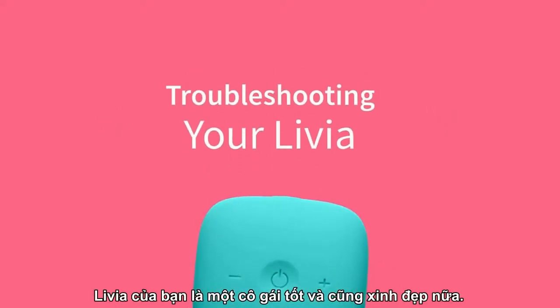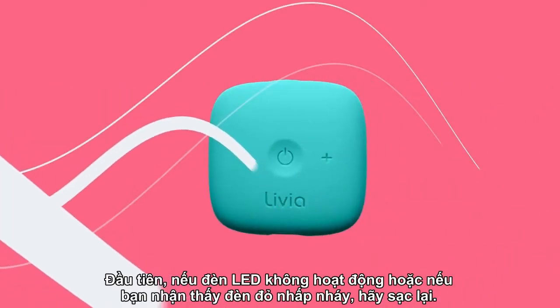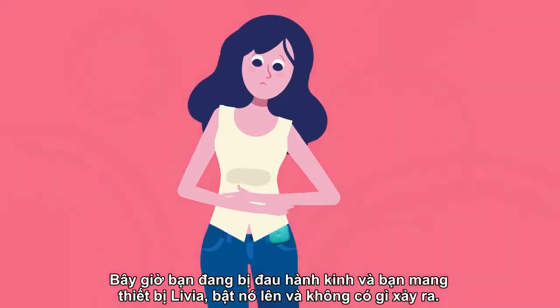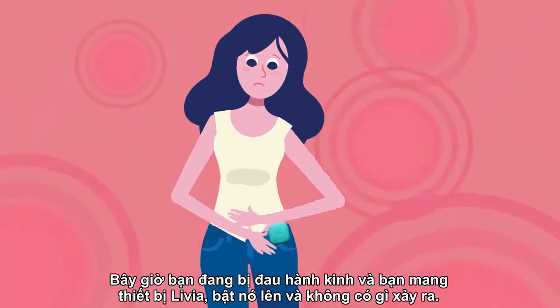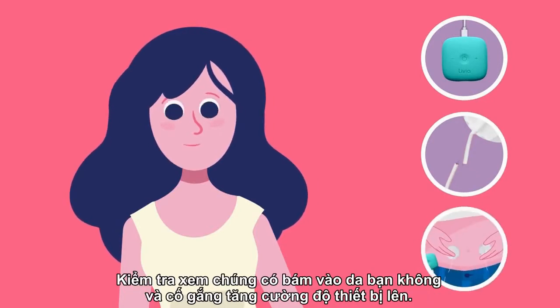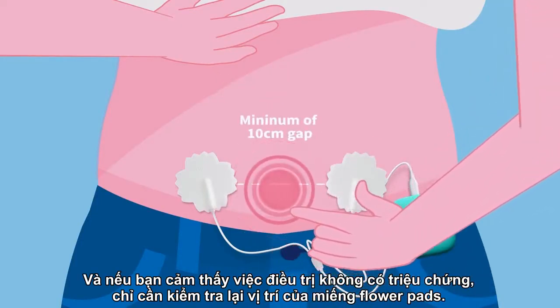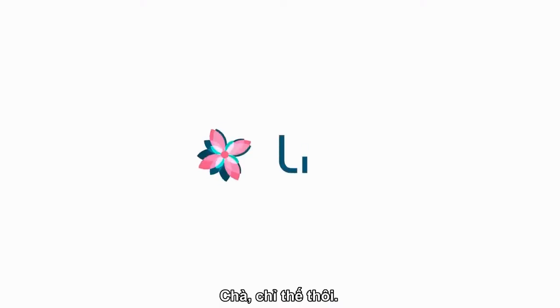Your Livia is a good girl and a pretty one as well, but you should know how to troubleshoot it. First, if the LEDs don't work or if you notice a flashing red light, just recharge it. If you're wearing your Livia, turn it on, and nothing happens, verify the flower pads are connected and not damaged in any way. Check that they are well attached to your skin and try to increase the treatment intensity. And if you feel the treatment is asymmetrical, check again the positioning of your flower pads and make sure you've put them symmetrically on both sides of the pain spot.